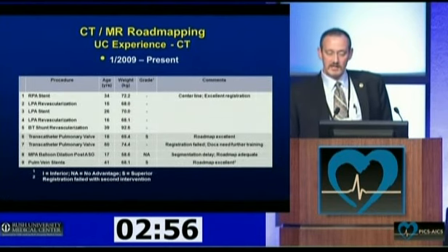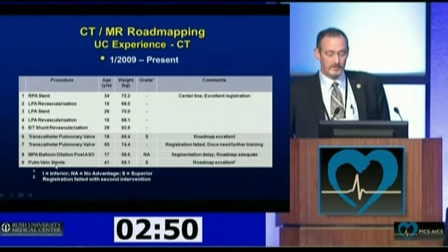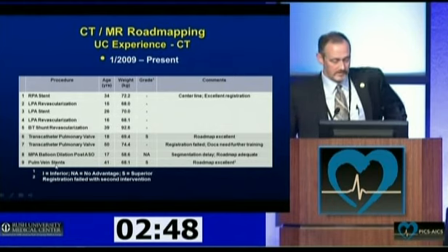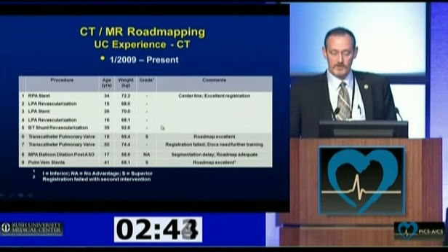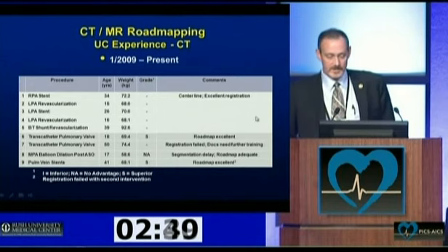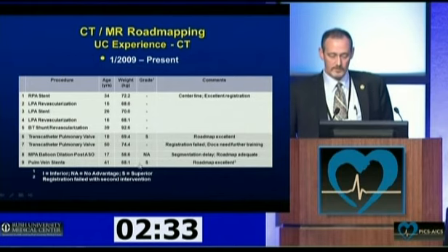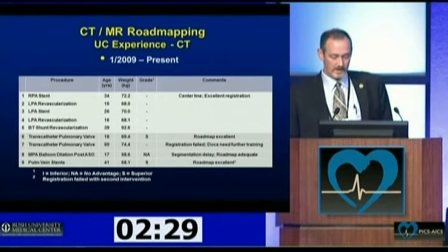Our CT experience is actually longer than that for the MR. The majority of these are pulmonary arterial work, with the exception of the pulmonary vein patient, which was our very last. The first prototype wasn't part of our grading scale, and it was a little hard to go back and get that same information, so for the most part we left that out. Again, we see that as we move through this, we felt more comfortable, corresponding with our experience with the MR data sets as well.